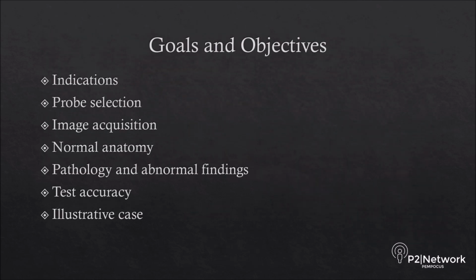Our goals for this talk are to discuss the indications, probe selection, image acquisition, normal anatomy followed by pathology and abnormal findings, and the test accuracy of point-of-care ultrasound for small bowel obstruction. We'll end with an illustrative case.